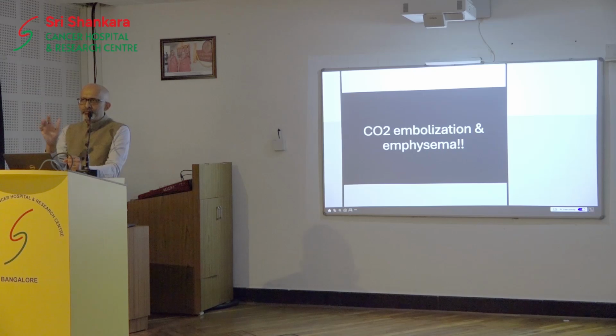Otherwise, it does not. So what we generally do is we ask the anesthetist to look at the EtCO2 levels. Generally, when any vein opens up and carbon dioxide flows into the blood or gets absorbed through the raw tissue, EtCO2 starts rising.